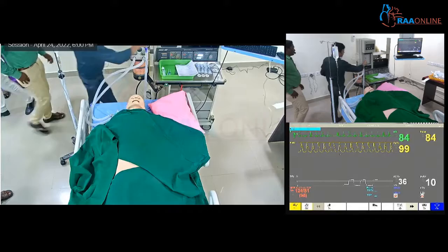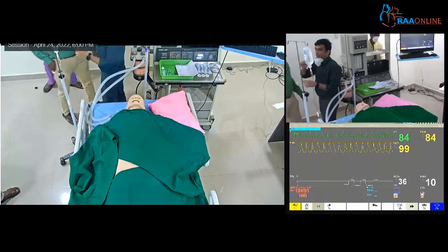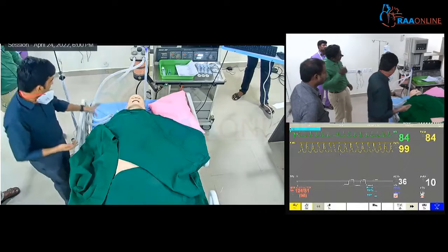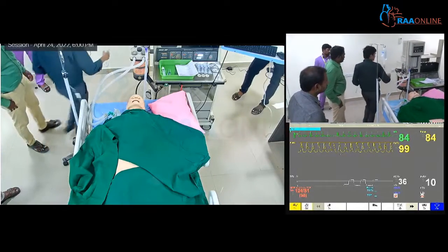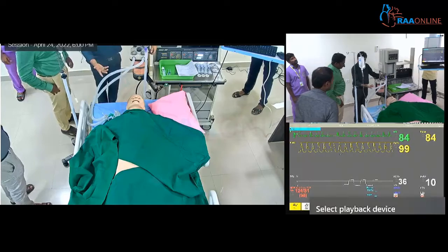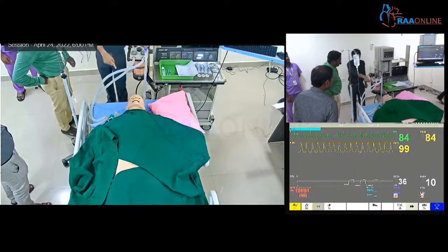Since we are going to use the cylinder, I'll prefer not using a flush, as it will get over quickly. This is a closed circuit, and this is a very old machine. Have you seen this? Have you used this? You can just close the APL valve like this, and then you can mask ventilate. You want to try mask ventilating? It's going to be a little difficult, but you can try. Just try it once.